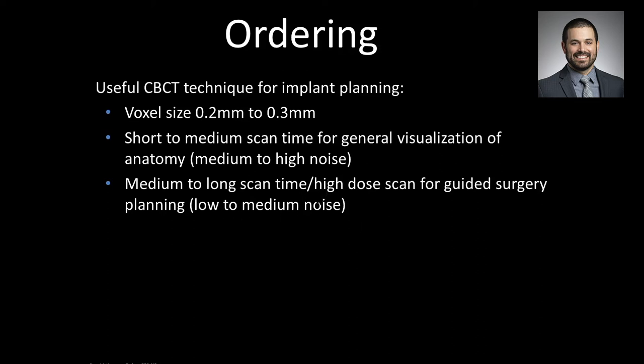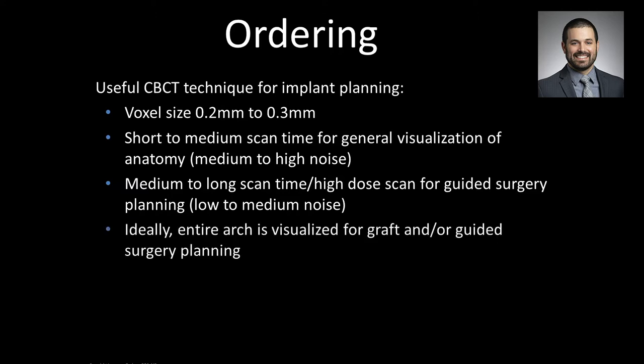And how we get that is you either turn on HD mode or you select that 30-second scan instead of the 15 or 10-second scan. It depends machine by machine. And if you just experiment, you can figure that out.